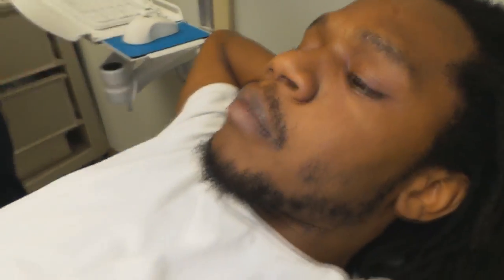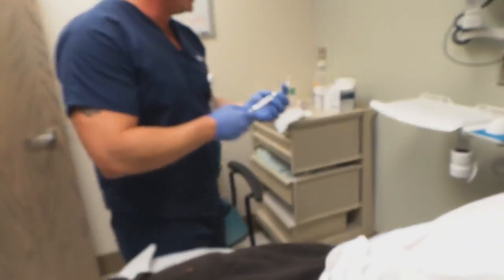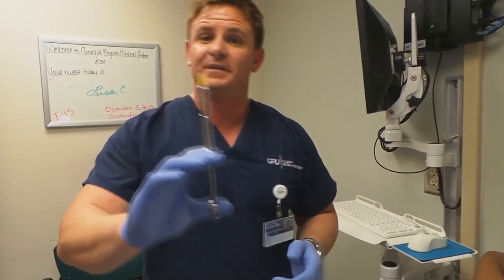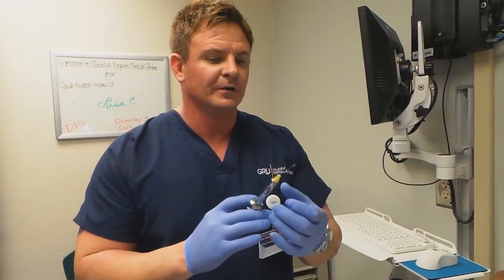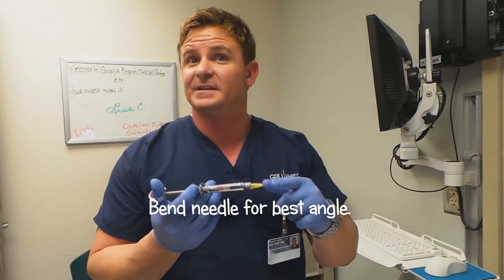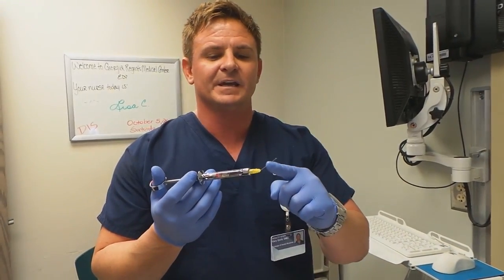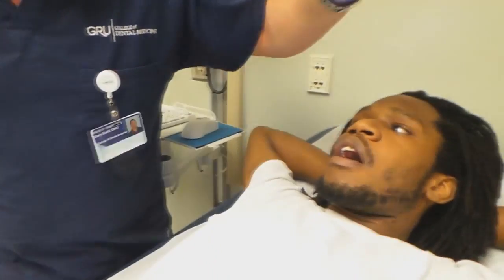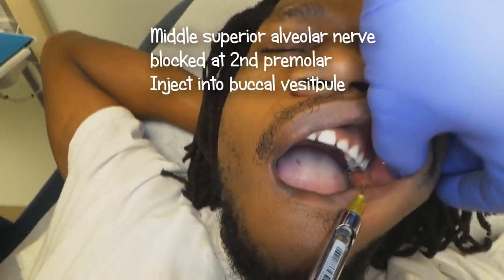So I'll demonstrate — what I'm going to give him is an MSA, because that's where the tooth is broken. You can bend the needle slightly like this to get the right angle, not too far. I'm only bending it because I'm not burying the needle to the hub — just in case it does break off, I can still grab and pull it out. I'm only going to take it in about this far. See where his tooth is broken? That's his second premolar — that's where you want to block the MSA.